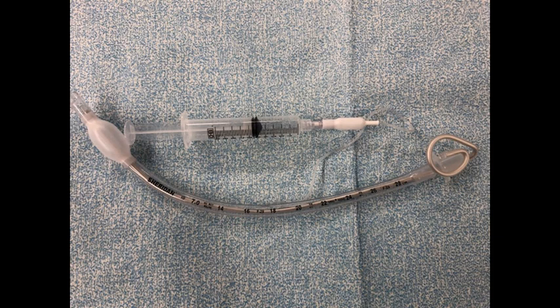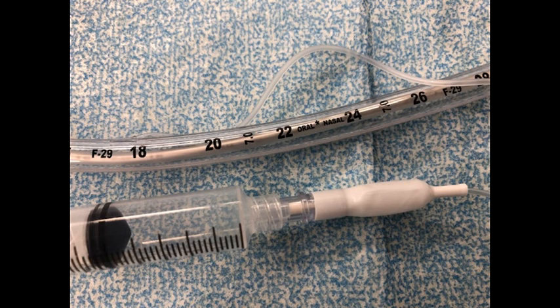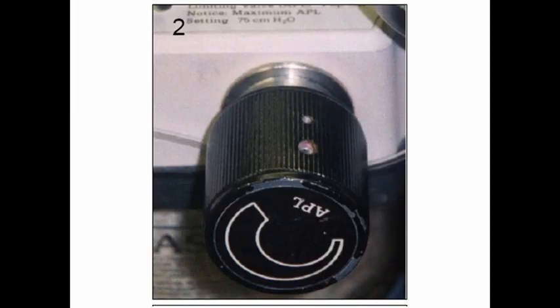A 10 ml syringe is attached to the pilot balloon and is used to inflate the cuff of the endotracheal tube. The tension in the cuff will be the same as the tension in the pilot balloon, and we can measure this tension if we need to.